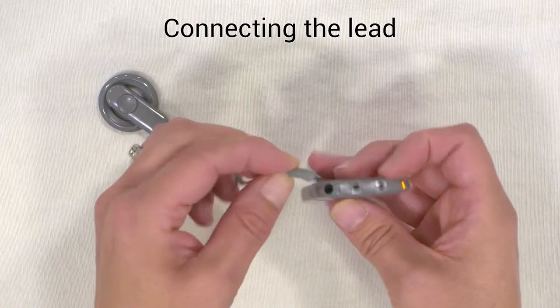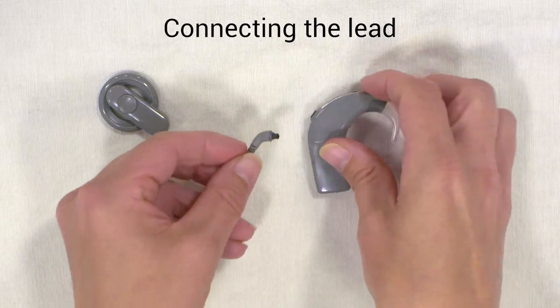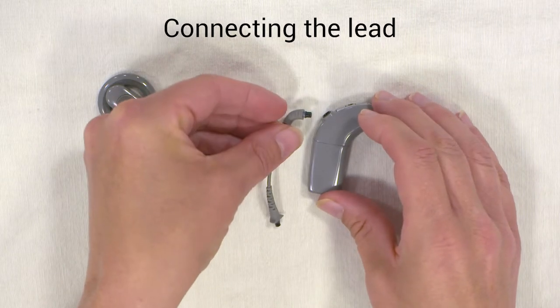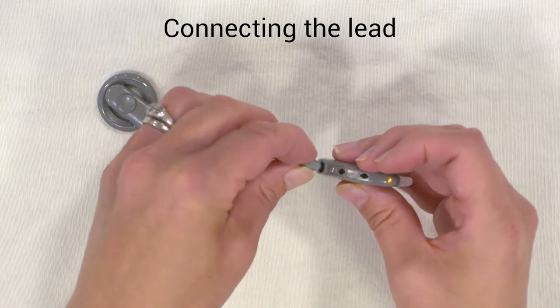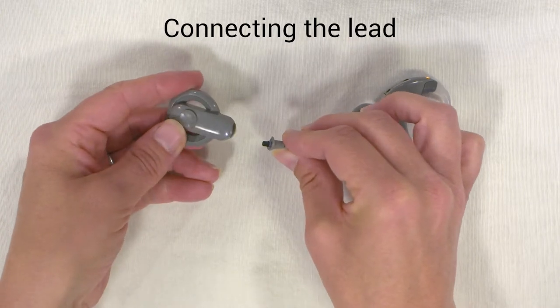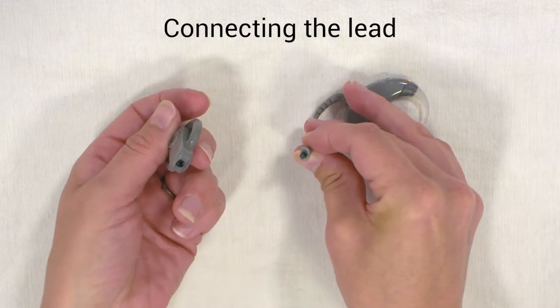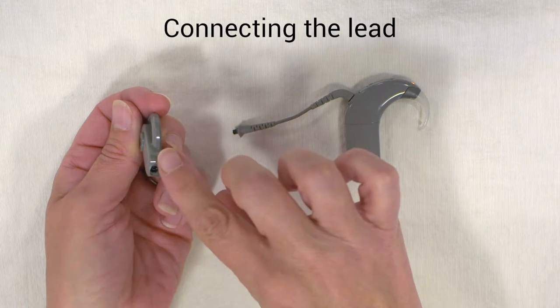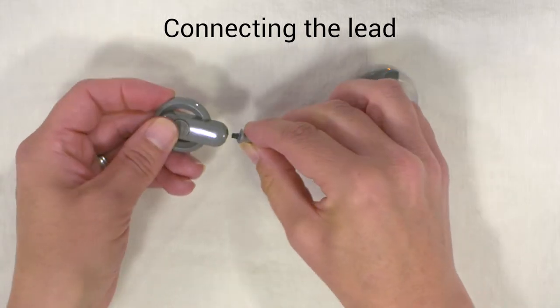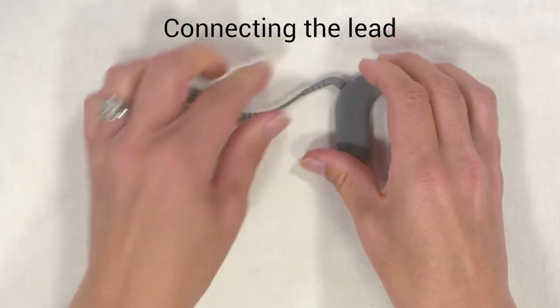The lead slots into the hole below the microphones and buttons. If you angle the lead downwards towards the battery, it slots in, and then the other end of the lead runs into the coil. You need to get the lead at the right angle — there's a curved shape at the top of the coil and a curved shape on the lead. If you match those up, it slots in. Make sure they're in firmly on both ends.